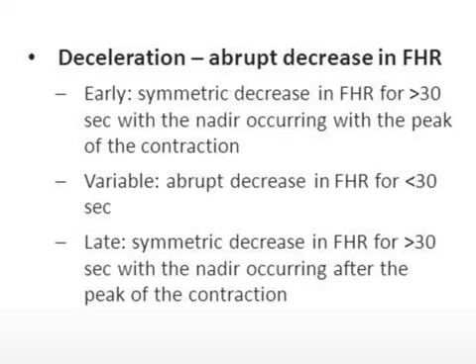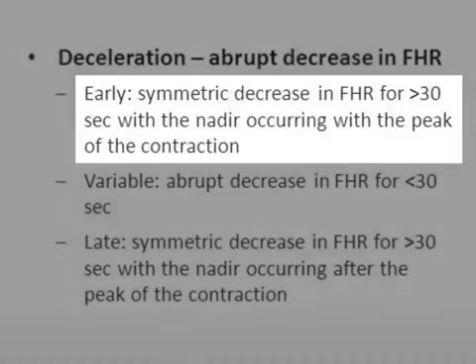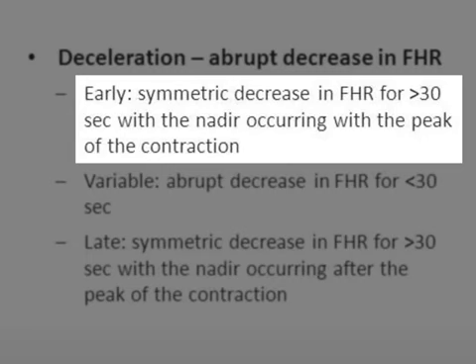Decelerations are defined as early, variable, or late. Early decelerations are a symmetric decrease in fetal heart rate for greater than 30 seconds with the nadir of the fetal heart rate occurring with the peak of the contraction.